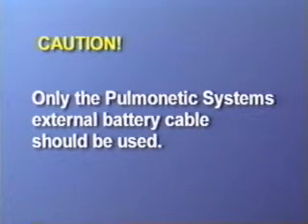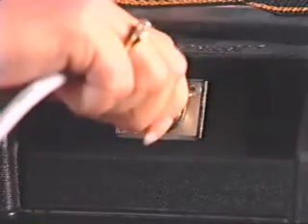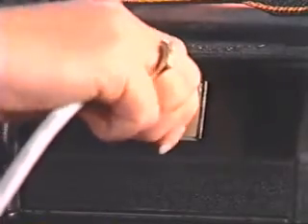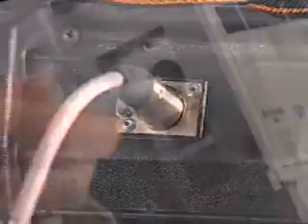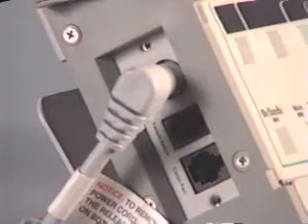This external battery cable is pre-wired and properly terminated to ensure safe connection of the external battery pack to the LTV series ventilators. To run the ventilator from an external battery, connect the battery cable quick connector to the port on the external battery case. Then connect the power connector on the battery cable to the power port on the left side of the ventilator.